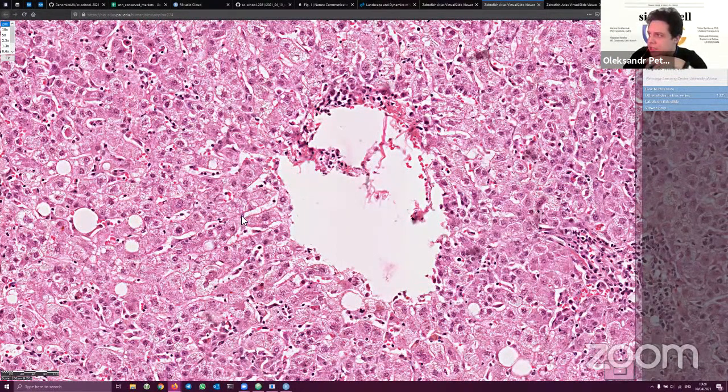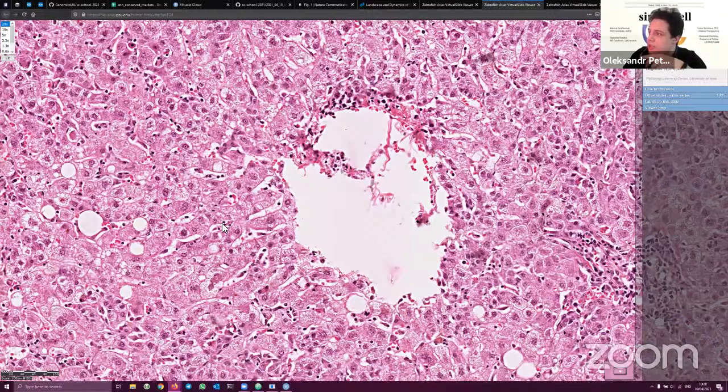And sometimes in these vessels, if it's not a pathological slide, but in this case, it's actually a pathological slide, you can see the infiltration, so small cells with dark nuclei, which probably indicate immune cell infiltration, in this case, with cells we cannot identify microscopically. So probably it's a neutrophil, but we cannot be sure. And actually, there's quite a lot of dark spots, which means that this is quite a severe infiltration. And since it's a viral hepatitis scan, we can assume that it's true.